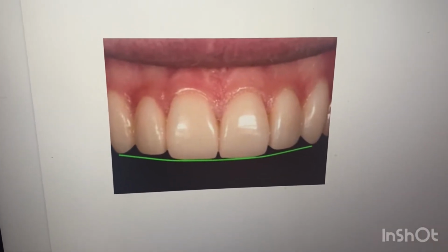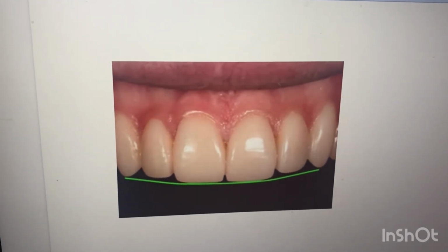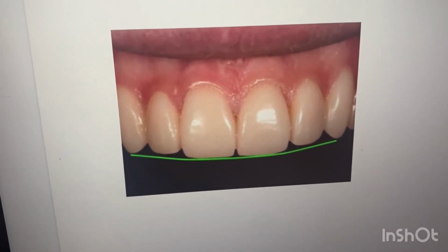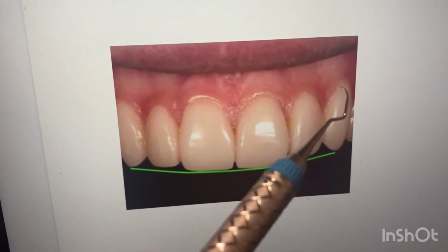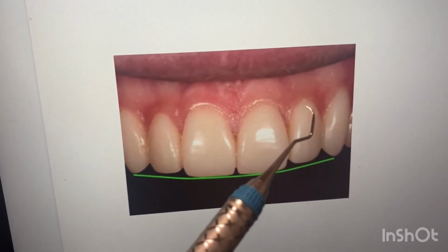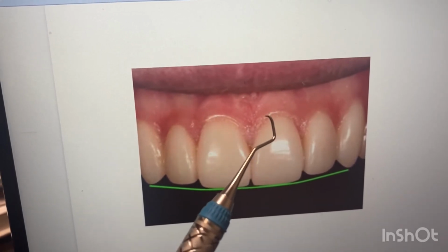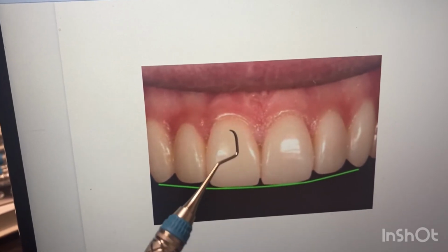Now moving on to the anterior teeth. We are going to work from canine to canine. Sitting at a 9 o'clock position, we are going to start on the canine on the midline and work on surfaces towards us. We're going to make sure that the terminal shank is parallel to the teeth, and we have to make sure to roll appropriately to avoid any tissue laceration.